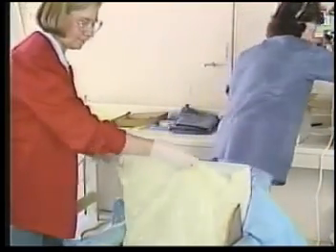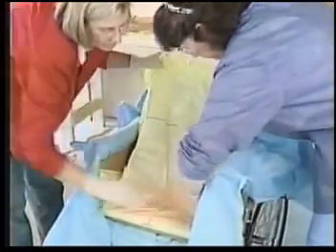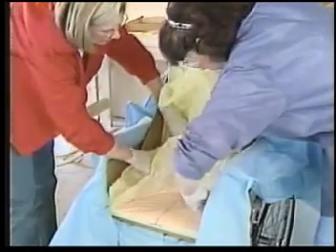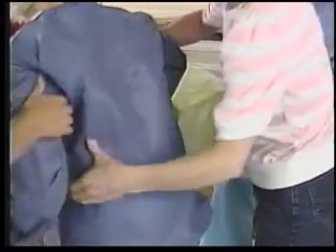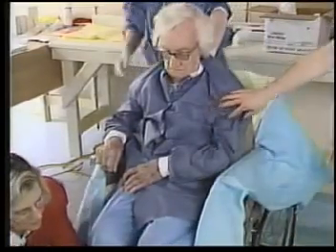Loosely close the molding bag by folding it back over the mix. You have 15 to 20 seconds to adjust the bag. Using your hands, press on the outside of the bag to move the mixture evenly around the base foam. The center lines on the bag are now useful in positioning the bag. If a pommel is desired, loosen the bag slightly in the front center to allow for foam expansion in that area. At this point, the therapists and assistants transfer the client onto the molding bag.